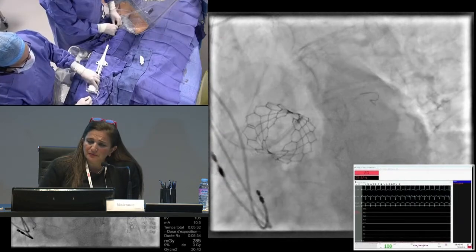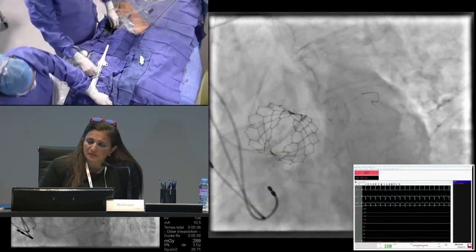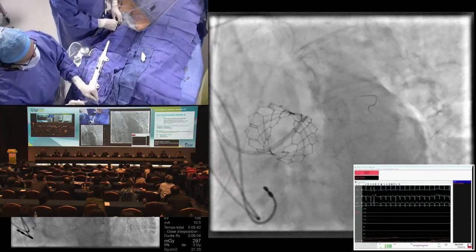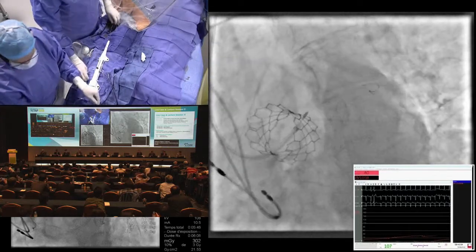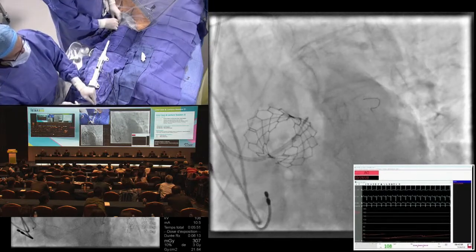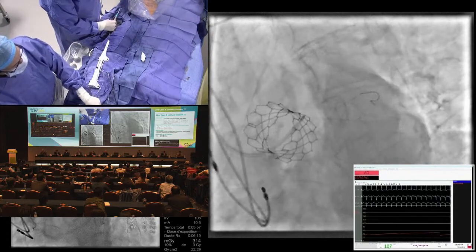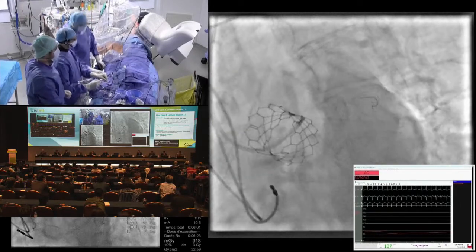Do you think some of those might be thrombus? Because you present with acute coronary syndrome. I think we can test now. John, why not start with 1.5? Yeah, but the patient has been treated with low molecular heparin, aspirin, and clopidogrel for 3 days now, so it should be okay. What we have to do is take a better support with the guiding, like that. And now we will start the ablation.